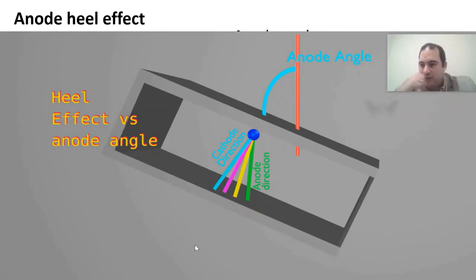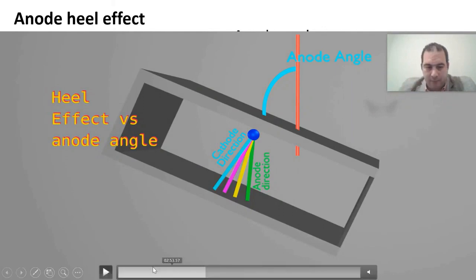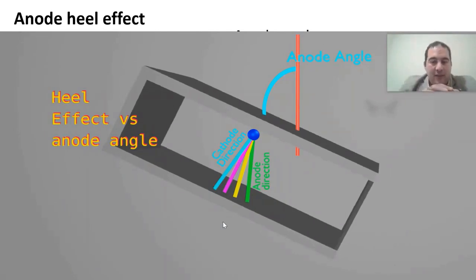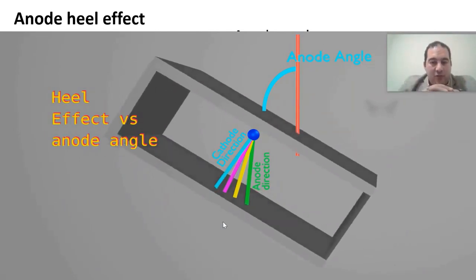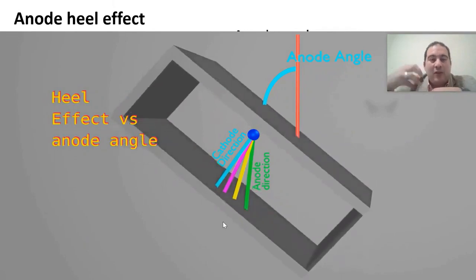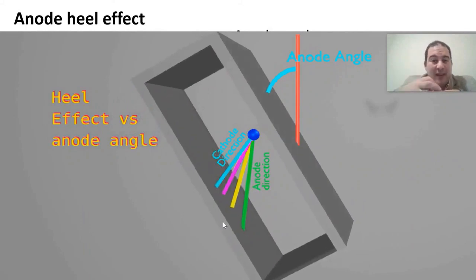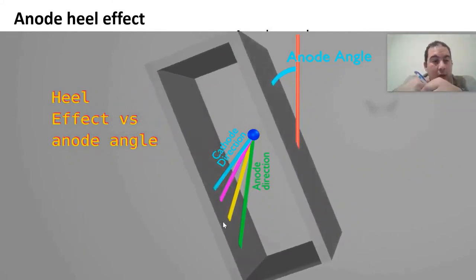Maximization occurs with a small anode angle. This principle is vital in various fields, especially where precision is crucial. For instance, in medical imaging, a small anode angle enhances image clarity, aiding accurate diagnosis. Similarly, in industrial radiography, it improves the detection of material flaws. Understanding when to use a small anode angle is key to achieving optimal results in these technical areas.